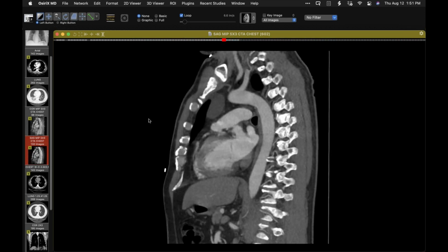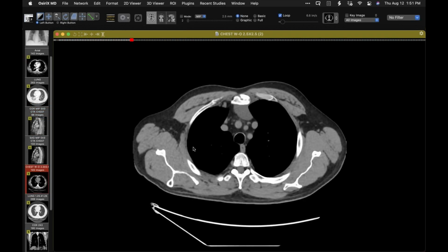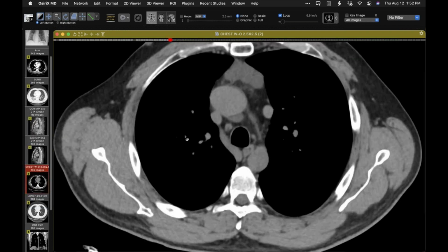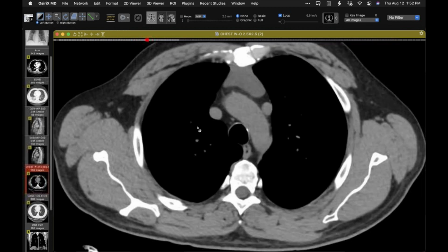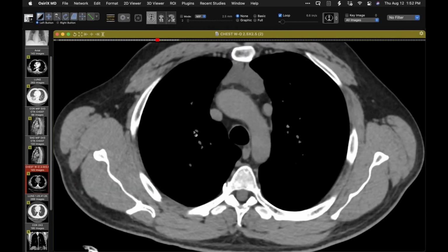Yeah, I agree that it doesn't need to be taken out. That's for certain. The only thing I worry about is that you miss a small solid nodule, that it's a cystic thymoma. But even those usually have more of a spherical configuration, unlike this, which just drapes nicely over the anterior mediastinum. Right. You can definitely make the argument that even an MRI is not necessary, and you can just follow it up. Or follow it with MR in 6 months or a year. Yeah, I agree with that actually.